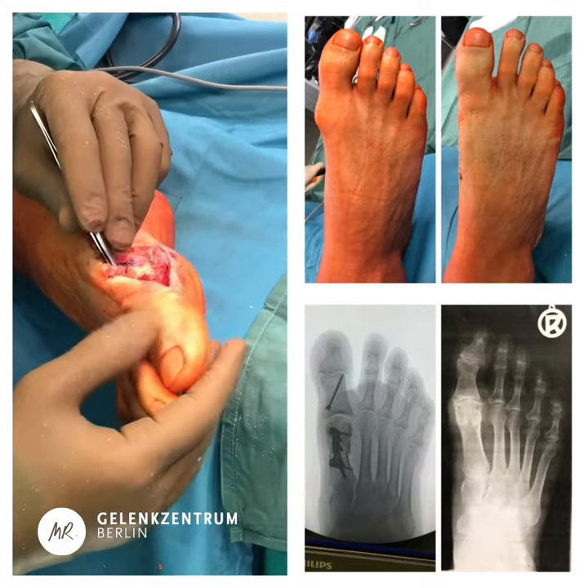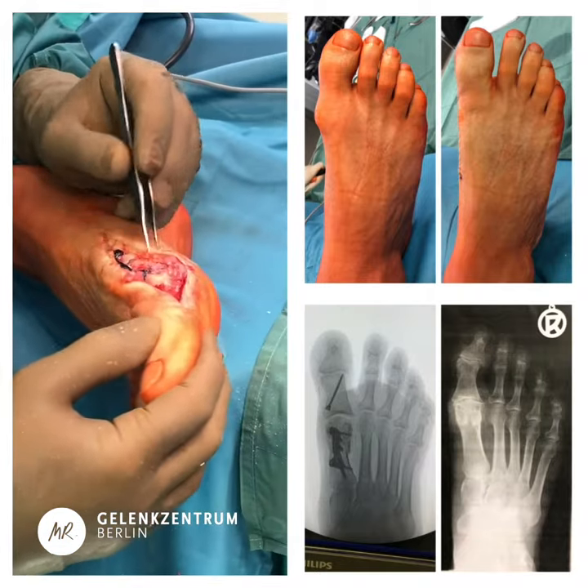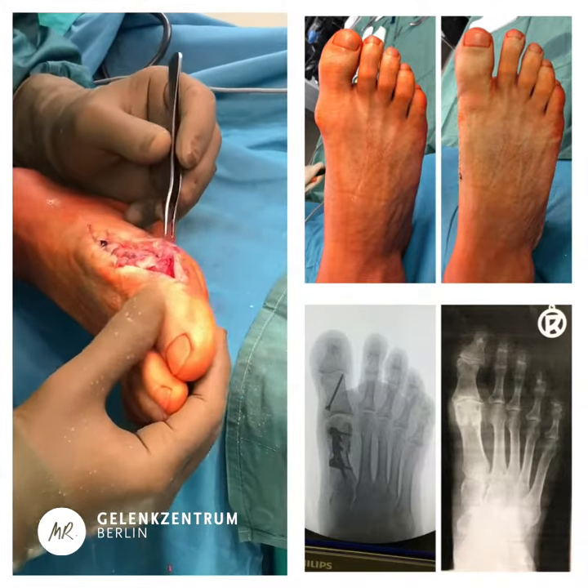The dorsum of the first phalanx can now easily overcome the obstacle that is no longer there. This is how we do it and this is how it works. Thank you.